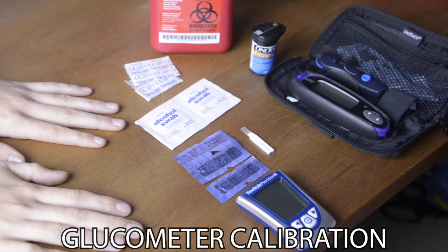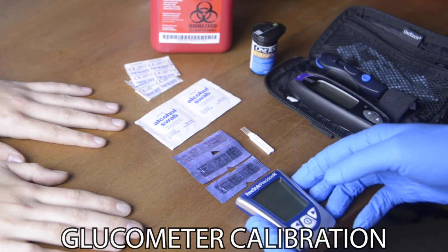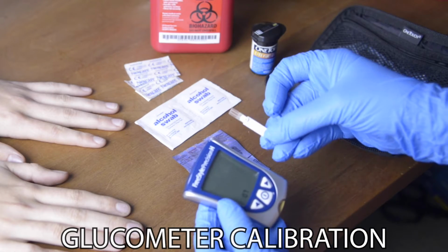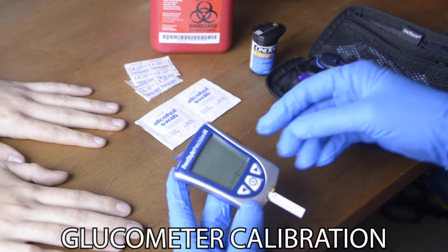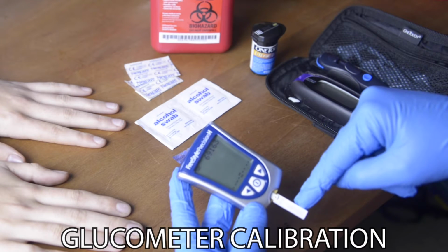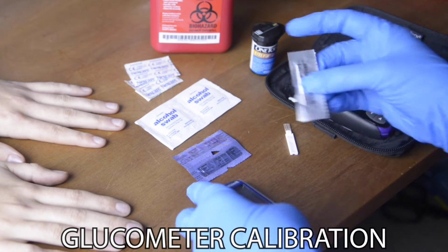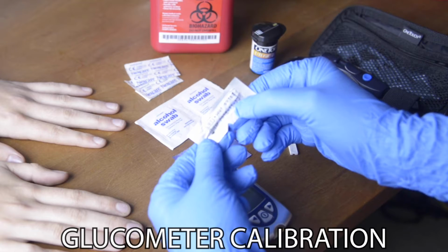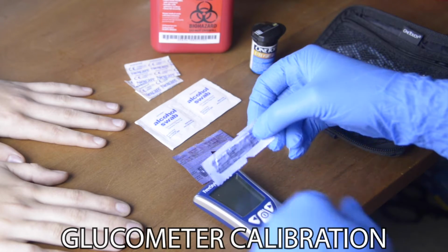So in order to test a blood glucose, if you have a calibration style meter, you need to use a calibration stick which tells the meter the lot number that your test strips are from. So this one's red, 69163. That means I need to use lot number 69163 within a reasonable expiration of the same type of test strip.